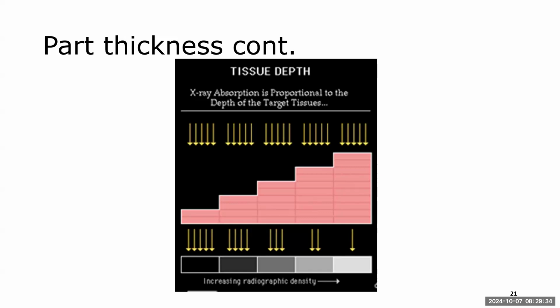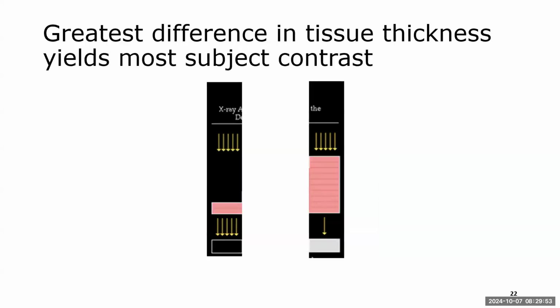Those marshmallows that are completely white had very little exposure to them at all, if any. The whitest of the white means that no exposure was there. So that means that no photons made it through to that particular area on the image. Okay, so the greatest difference, so what I did was I took the two extremes of that image.